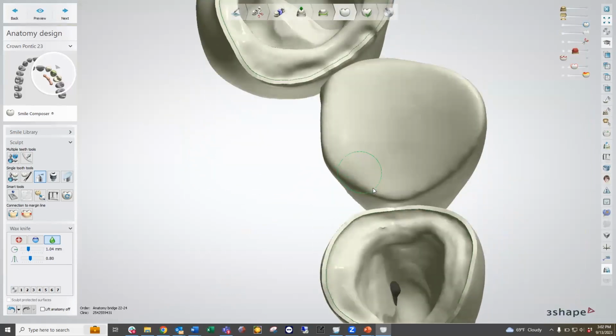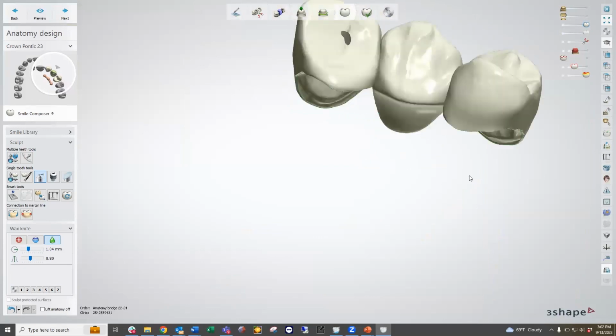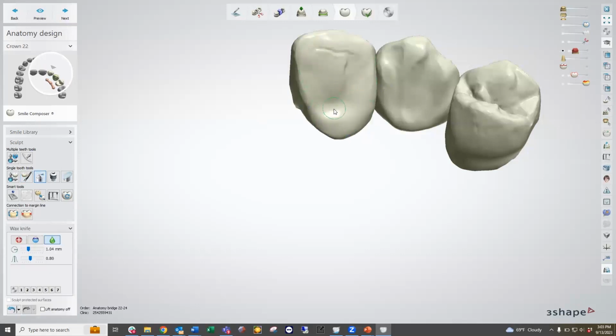So once we have that design solidified, we can then take a look at all our units together and see how they look and make any adjustments as needed. If I turn on my minimum thickness, I can see that I'm very thin here. So I'm going to go back to a bigger change tool, and I'm just going to use the morphing tool to drag this out. Okay, making sure that I'm clicking and dragging up to add material to that area. And then I can use my smooth tool as needed.